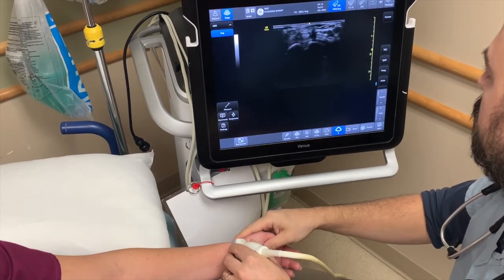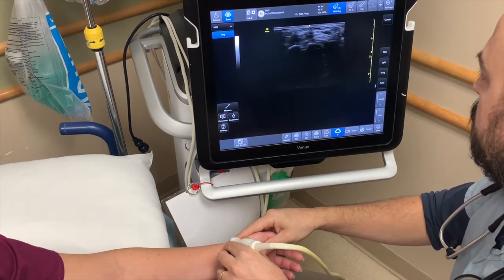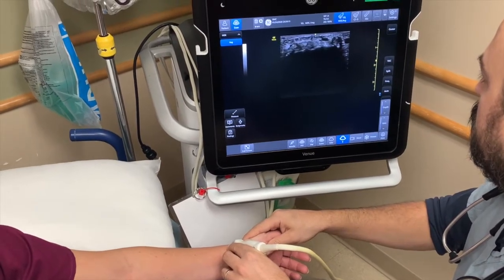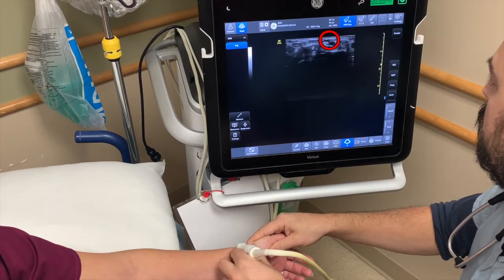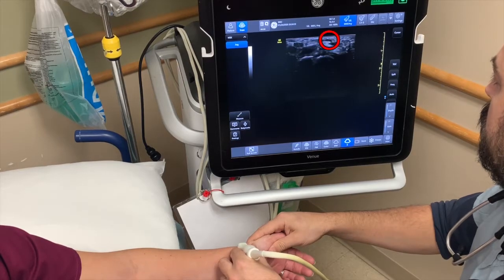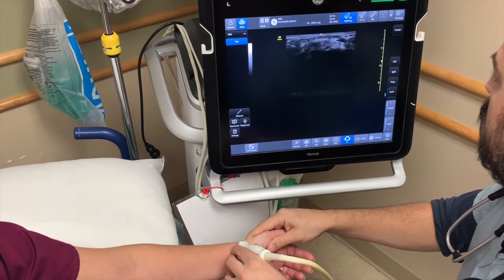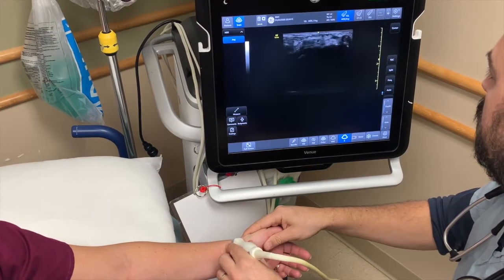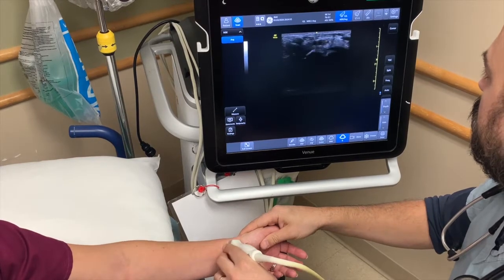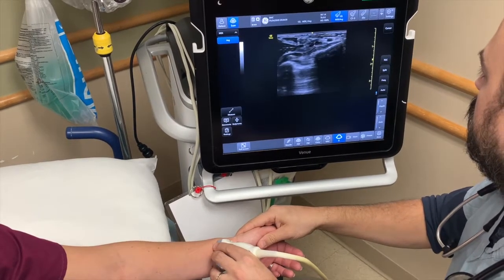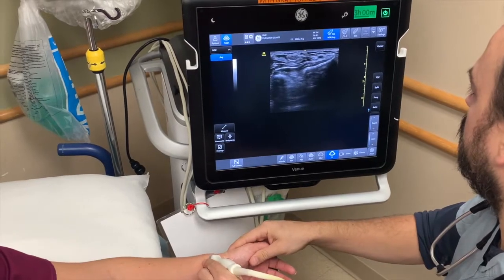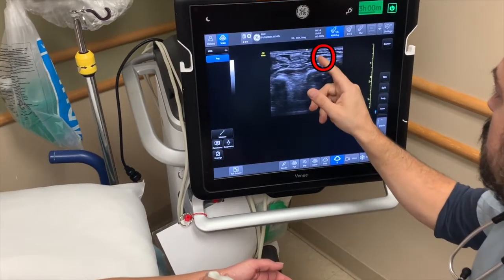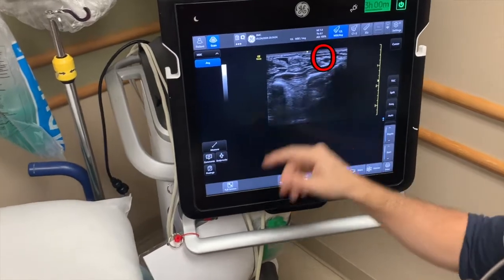Looking over on the radial side, we'll see the radial artery there. And along with that, the radial nerve, which is sometimes a little bit more tricky to identify.